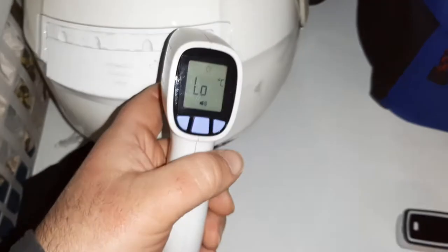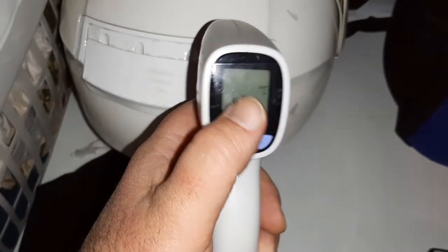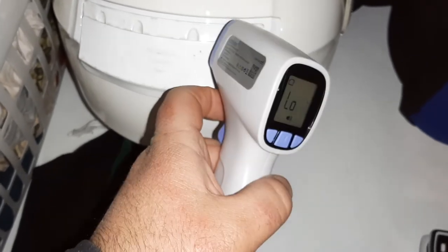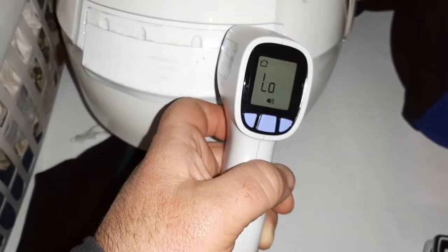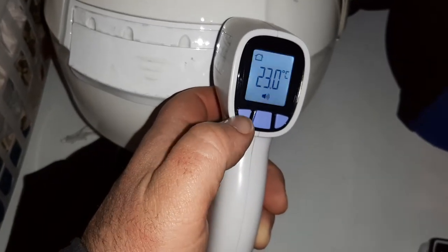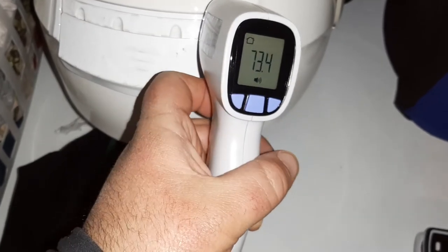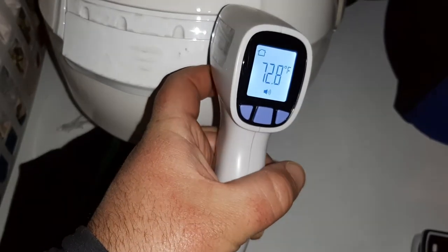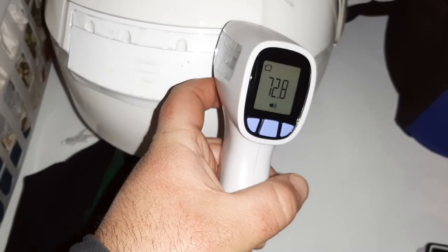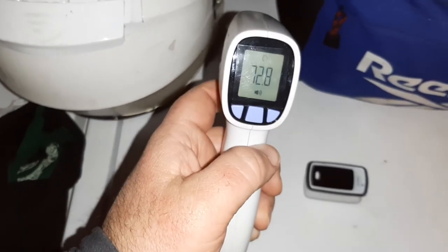Right now it's set to low, but if I come in close you can see that's a human being icon up top right there. If I push the mode button, that'll switch over to object mode. So you want to get about a half an inch away from the object, press the button — 23 degrees Celsius. To make that Fahrenheit, push this button right here — boom, that'll turn to 73.4 Fahrenheit. The cooler blue color usually means that it's cool. To go back to human being mode, you push the middle button.